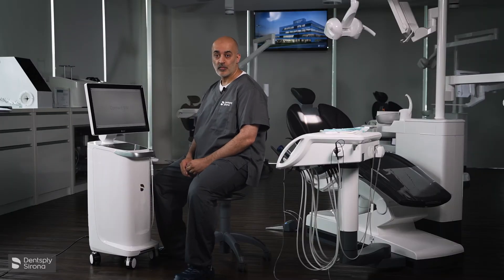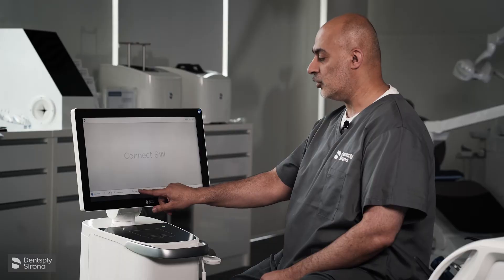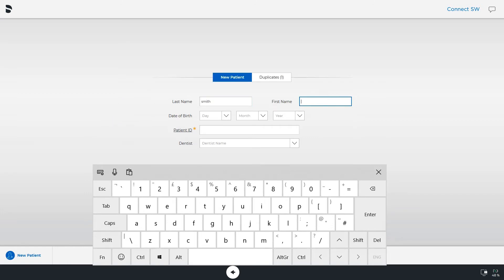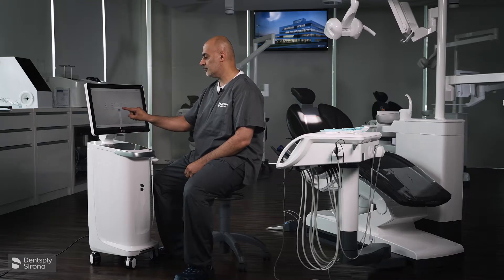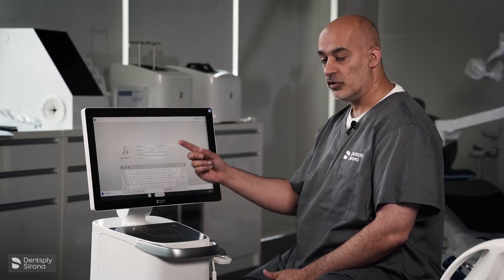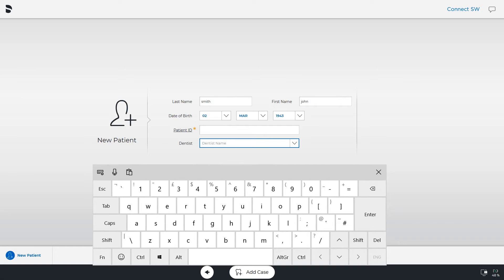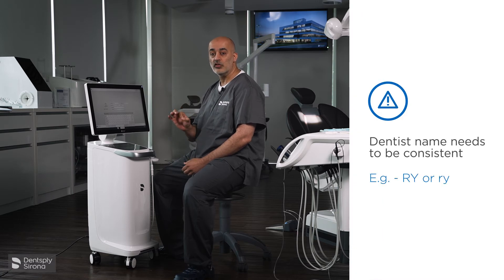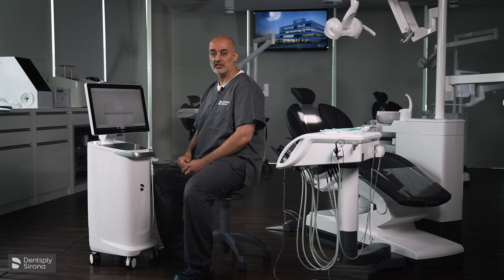Now we're on to recording. Before we go to scanning the patient, we need to create the patient file. At the bottom of the screen, select 'add new patient' and input the patient details — for example, Mr. Smith, date of birth. Patient ID is optional. When it comes to inputting the dentist name, you need to be consistent. If it's your initials, like mine would be 'ry,' you need to have it consistently in either lowercase or uppercase for every patient file, otherwise you'll create a new folder and may forget you've taken a scan for that patient.